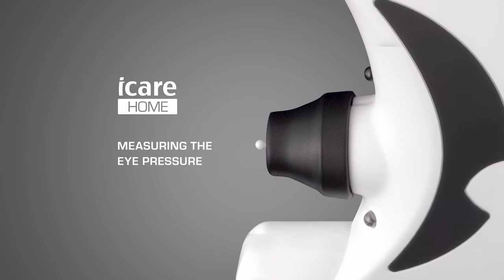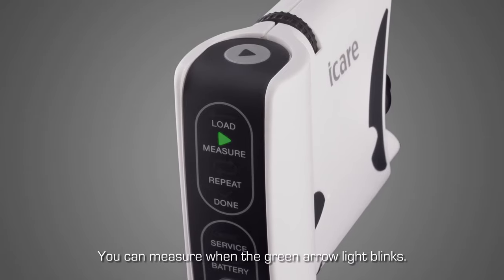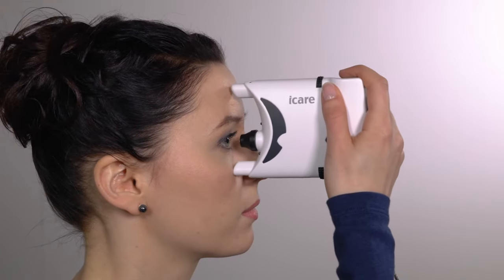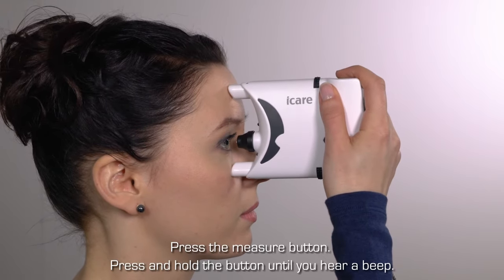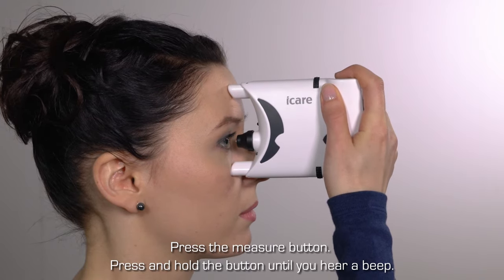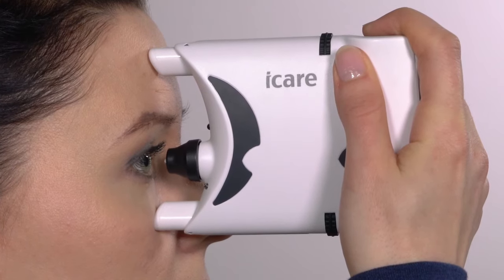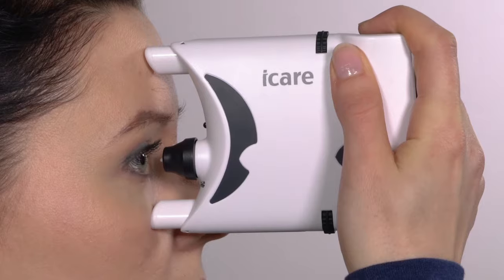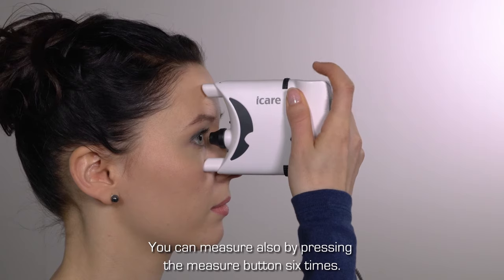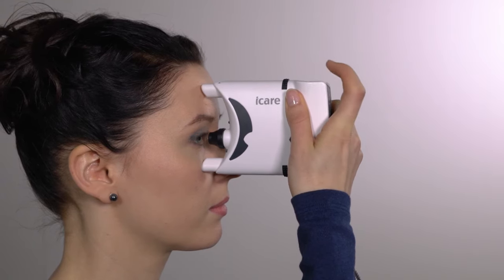Performing a measurement. The tonometer is ready to measure when the arrow light on the display panel is flashing green. Place the tonometer against your face. Press the measure button and keep it pressed down until you hear a single beep. The probe will gently touch the surface of the eye six times. You can also perform a measurement by pressing the measure button separately six times. After all six steps, you will hear a beep.